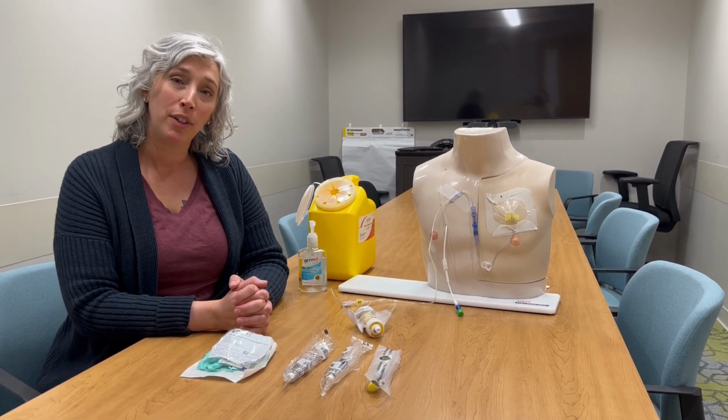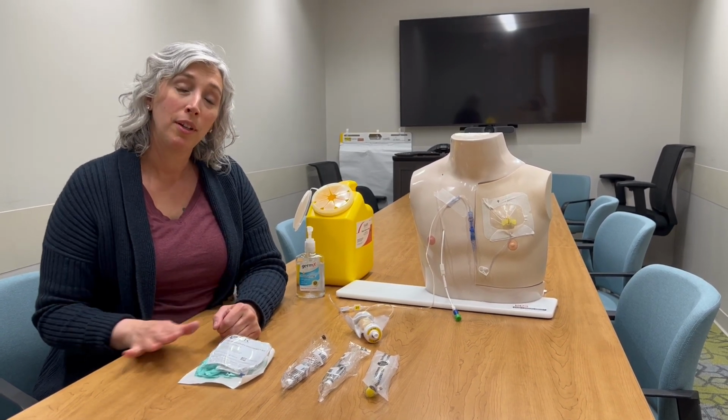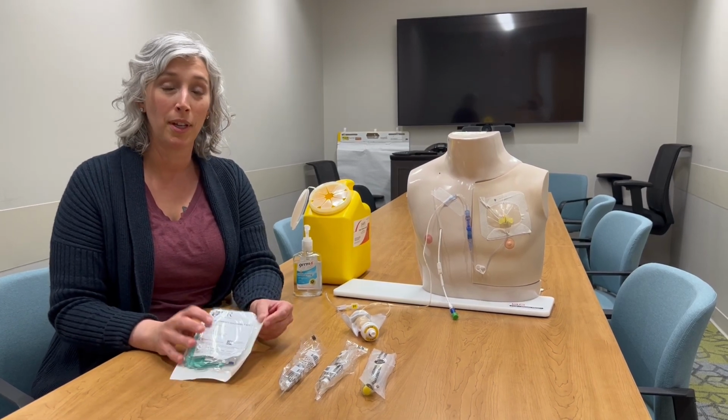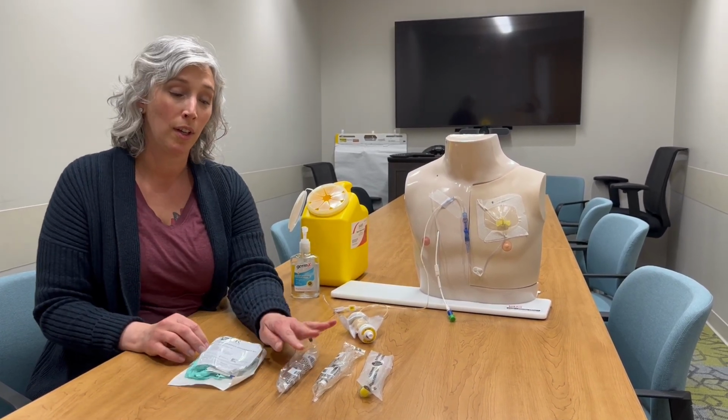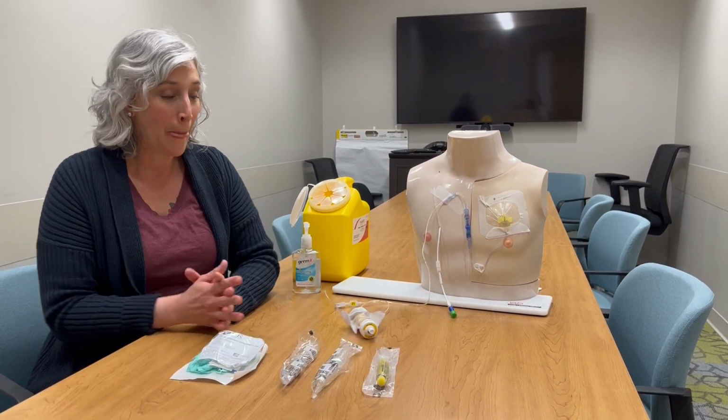You want to make sure you have a clean work surface to set up your supplies on, so you want to clean with a paper towel and spray cleaner or a disinfectant wipe. Then you can set out your supplies. We have our chemo disconnect kit, 2 saline flushes, and our heparin flush, which is yellow.